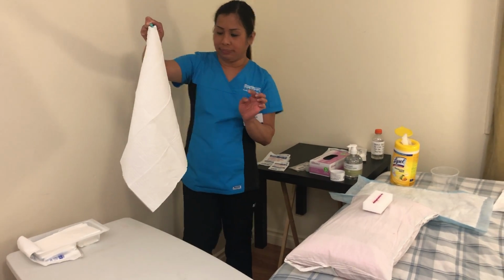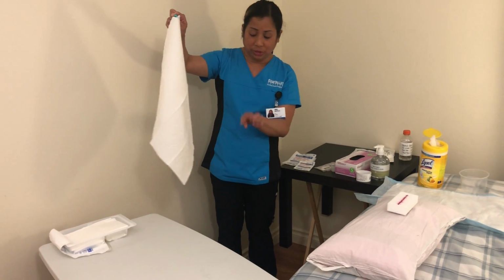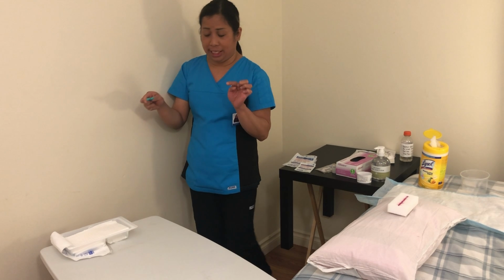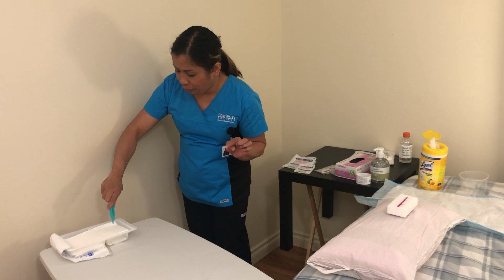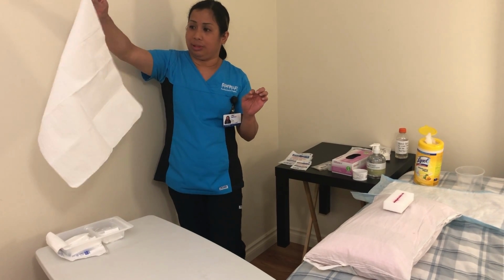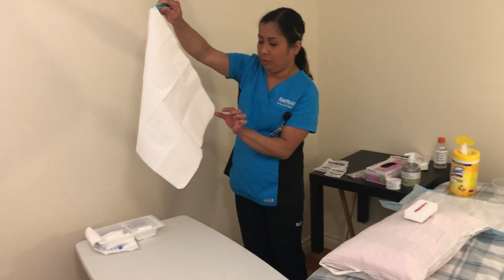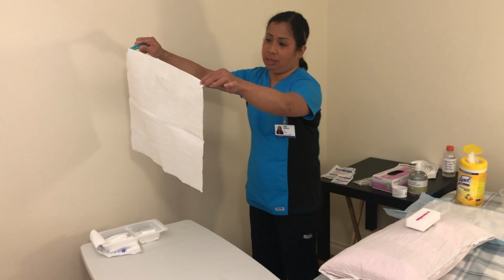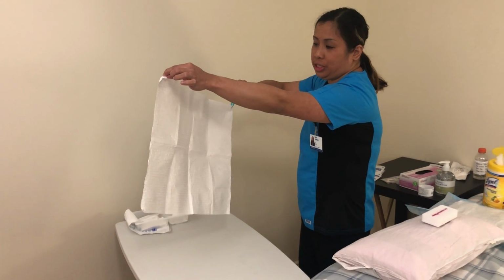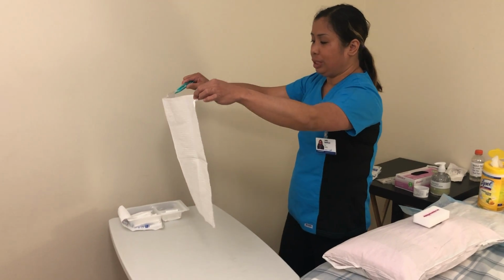What I mean, I think I touched already my purse strip, so I'll discard this one. So I'm gonna use my second strip. So I will make sure that, okay. So this is my second strip. Okay, I will touch the other edges of the strip, and then I'll show it to you that I'll make sure that the shiny side is under or on top of the table.